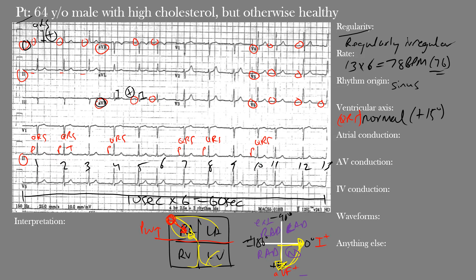With children you tend to see more rightward axis because in utero the right ventricle is the dominant portion of the heart, whereas in adults the left ventricle takes over and things shift leftward with age. The axis here was positive 15 degrees, which sits well within the normal range. So the ventricular or QRS axis here is normal.